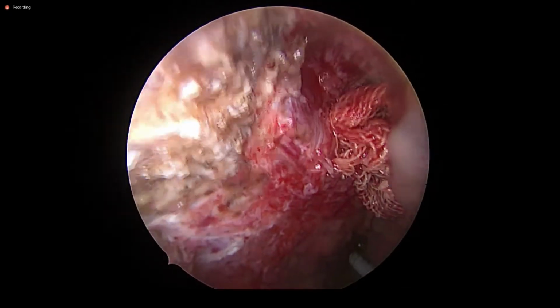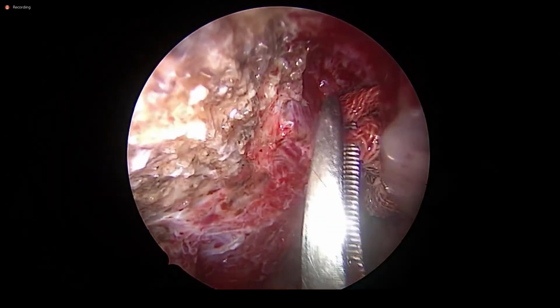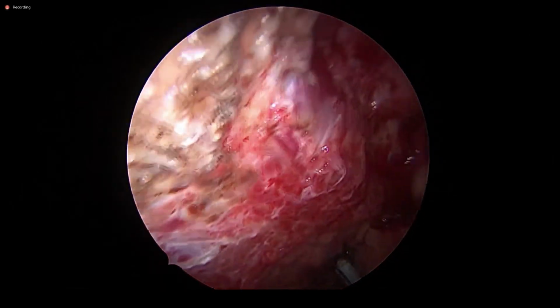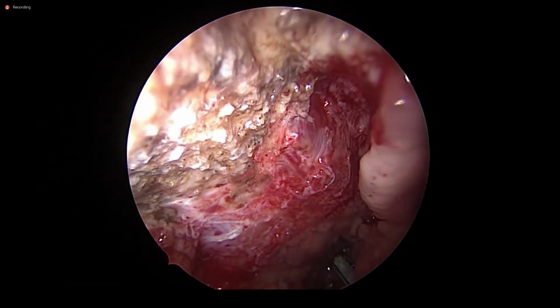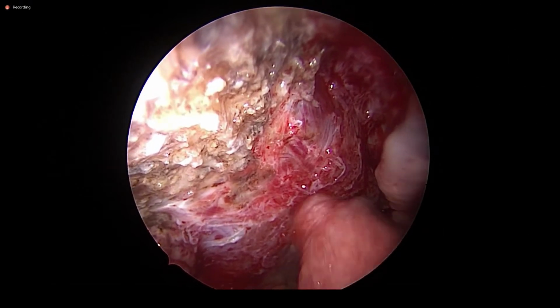And these are the adenoids which are responsible for persistent ear problems, and they can even regrow to a bigger size and obliterate the entire nasopharyngeal airway. Can you see this? Yes, sir. It is completely opened up with hardly any bleeding. Very, very safe.